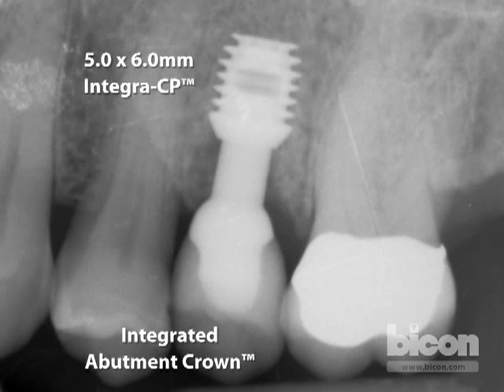The key to evaluating the integrated abutment crown radiographically is that it has a hemispherical base. As you can see, the hemispherical base — the titanium — is in contact with the bone, and not the indirect composite.